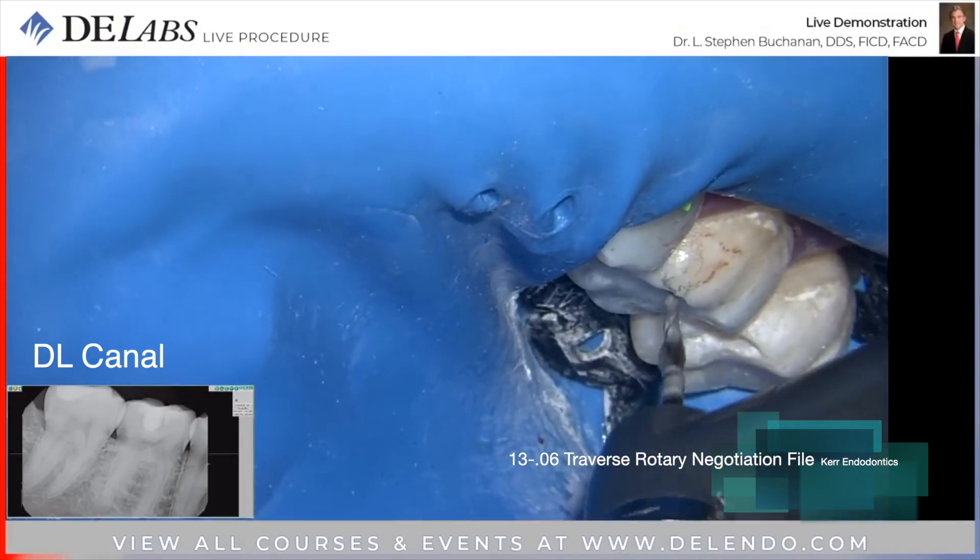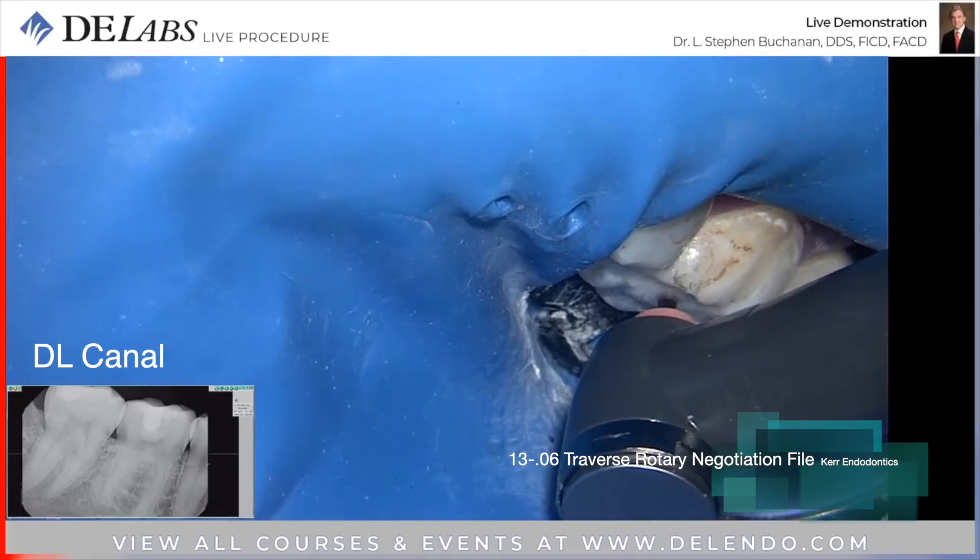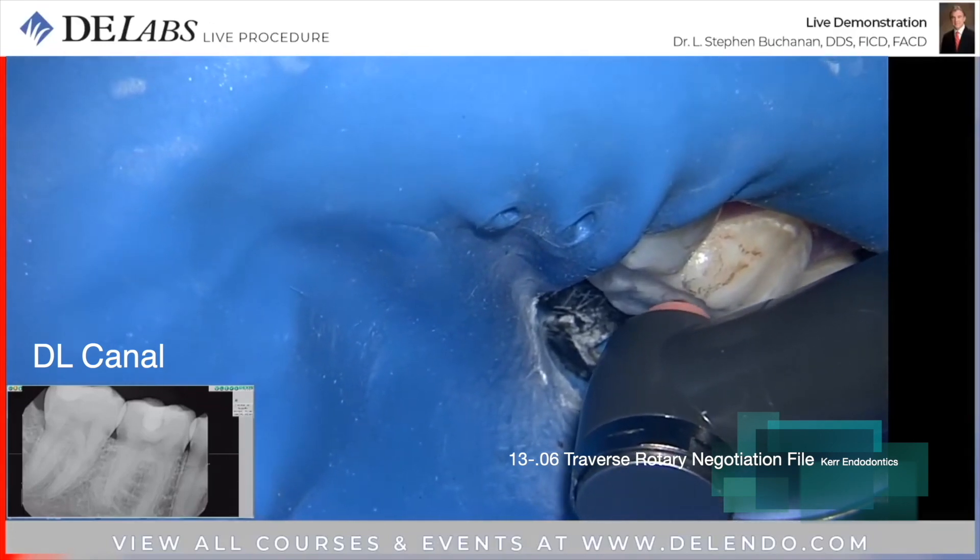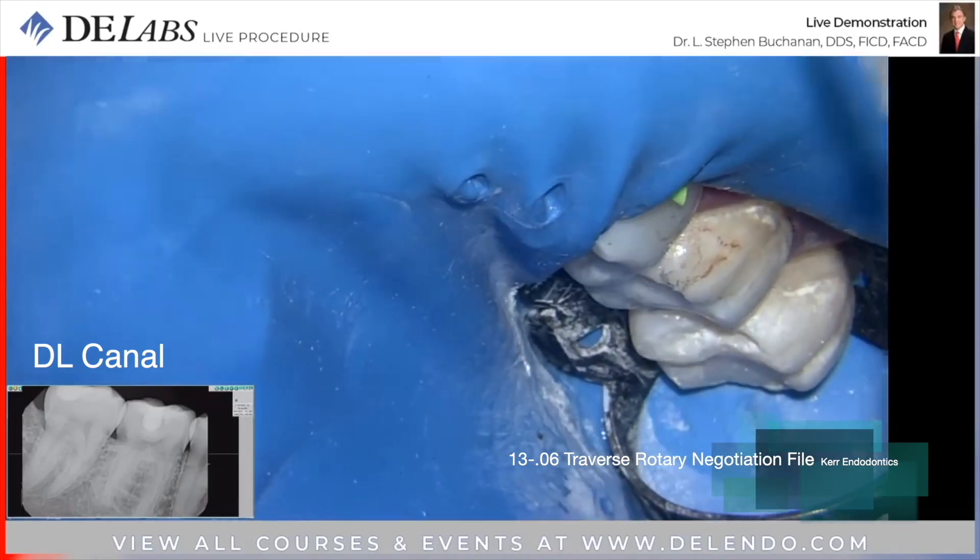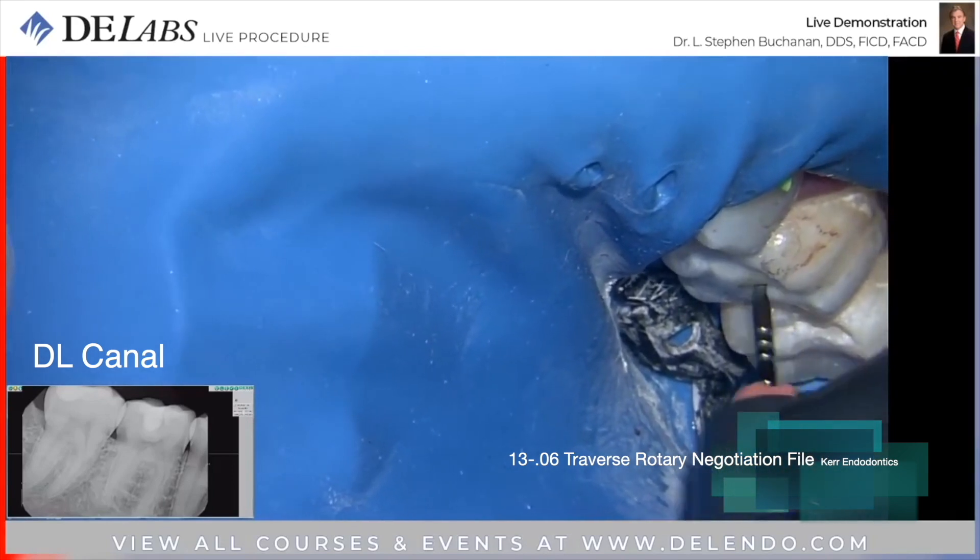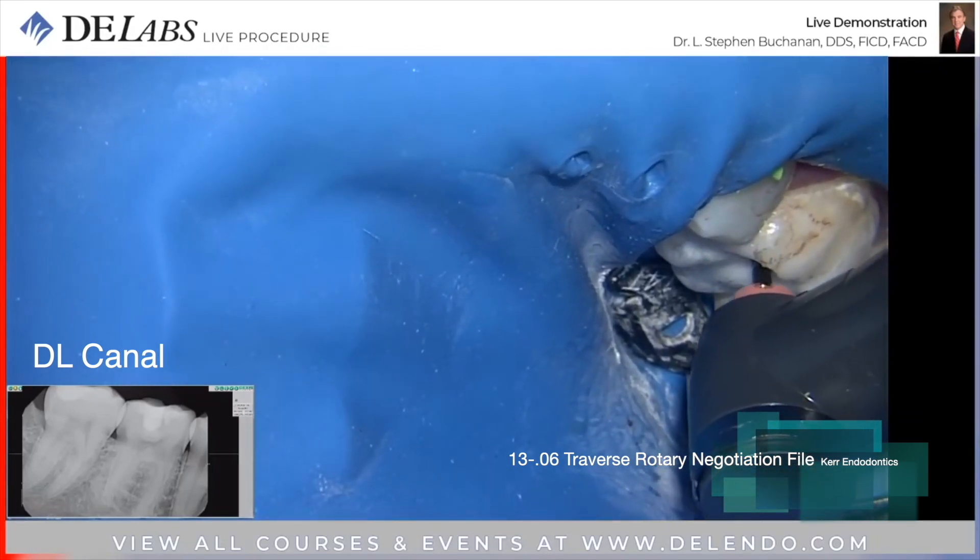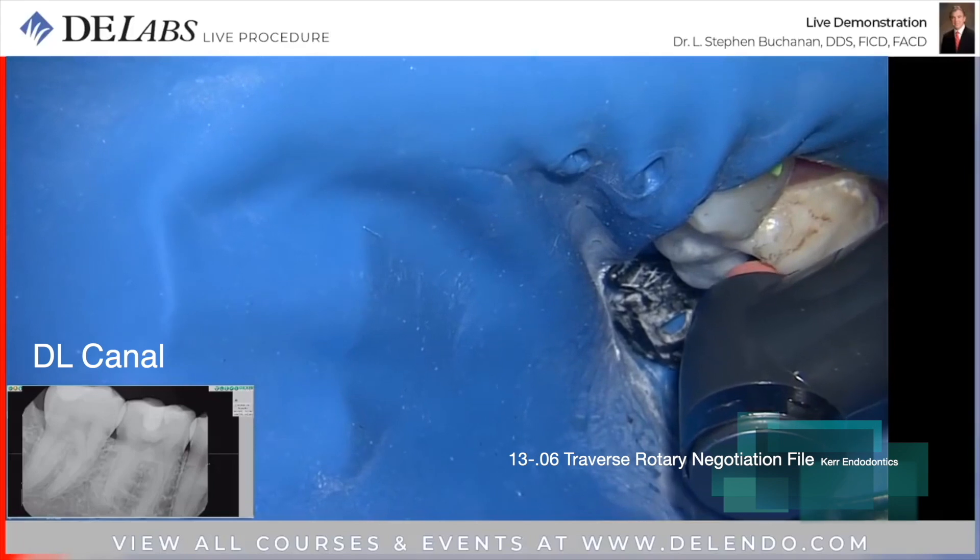The file is cleaned and checked. I'm powering it with Merida's Triado ZX2 cordless handpiece with the apex locator inside of it. Notice how the file just stops. Once it goes in there, it turns on and starts itself again.